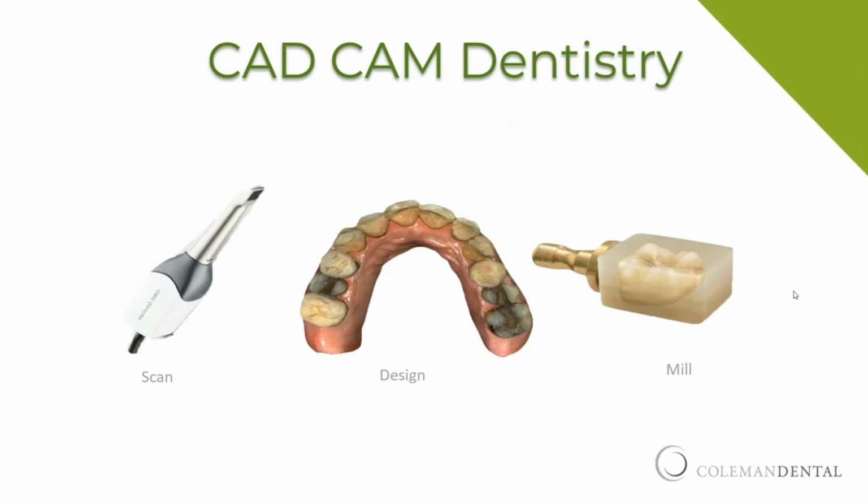This morning is a prime example. I had a patient fly in from New York that I had placed an implant in. I took the healing cap out of the implant, scanned the implant body and two crowns behind that, and put that healing cap back in. I said, hey, go get a Starbucks, we'll see you in about an hour and a half.